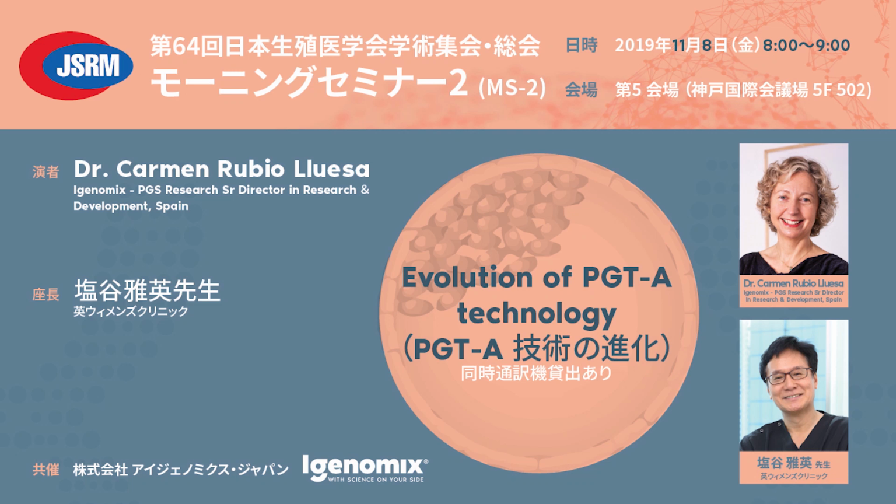It's also nice because of the conditions: if you do the vitrification and the media collection first thing in the morning, you avoid DNA contamination from the other procedures that you are going to do during the day. So just clean the surfaces, do the collection, and then start with your regular IVF routine. Thank you.